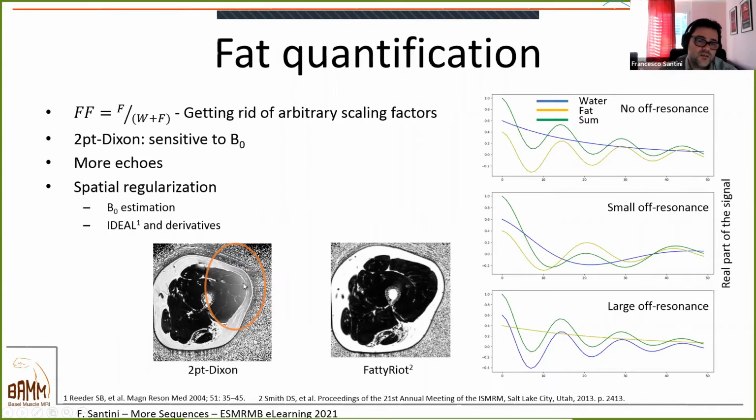Here, this should be water-only signal. This is in general a fat-only image. So you see the subcutaneous fat here is white. And here there should be very, very little fat, but because of B0 inhomogeneity, this appears bright, and this appears darker, even though it's 100% fat.